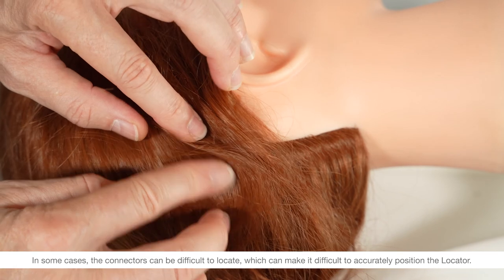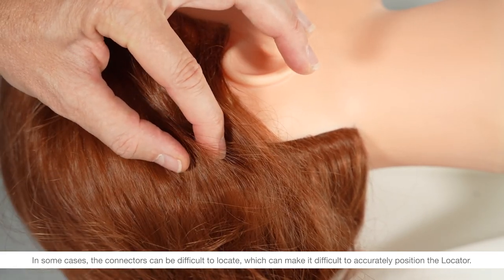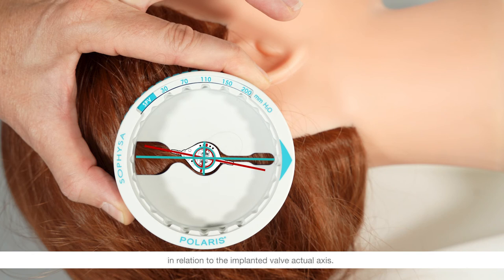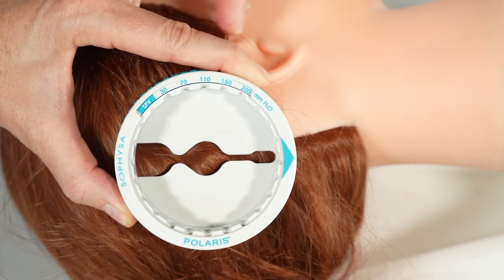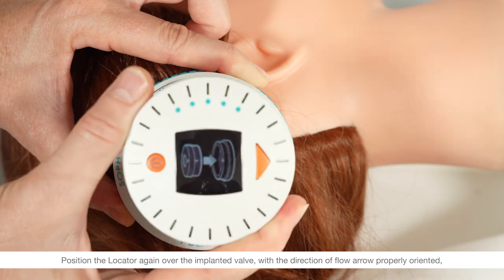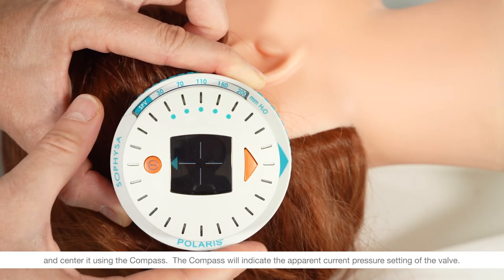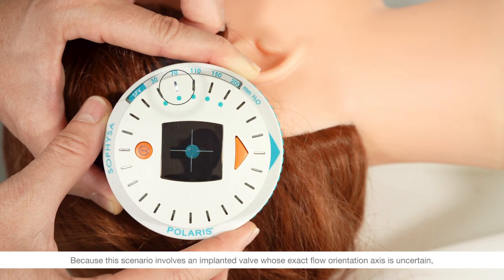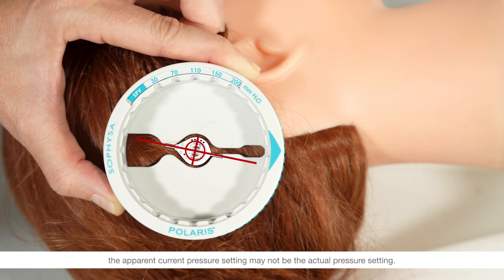In some cases the connectors can be difficult to locate, which can make it difficult to accurately position the locator. In these situations, the stop method will help you position the instruments accurately in relation to the implanted valve actual axis. Position the locator again over the implanted valve with the direction of flow arrow properly oriented and center it using the compass. The compass will indicate the apparent current pressure setting of the valve. Because this scenario involves an implanted valve whose exact flow orientation axis is uncertain, the apparent current pressure setting may not be the actual pressure setting. The stop method will eliminate this uncertainty.